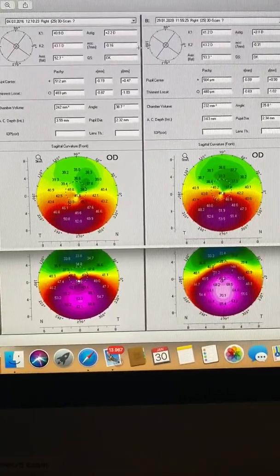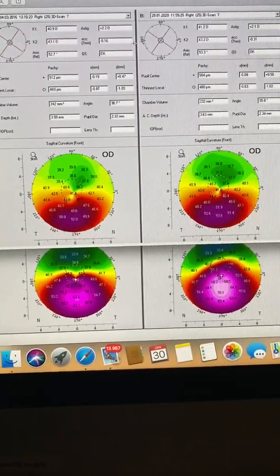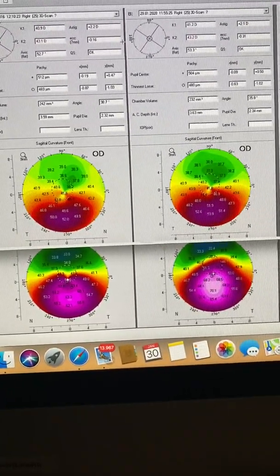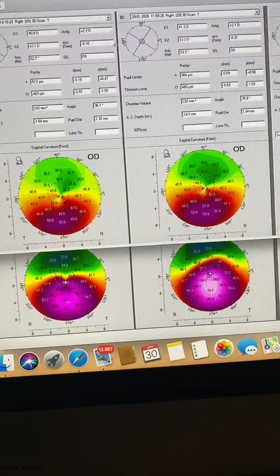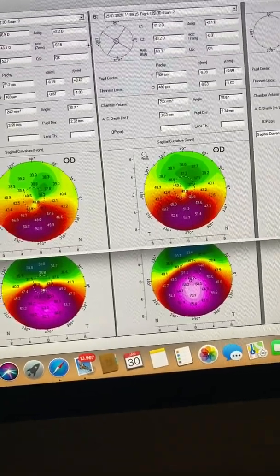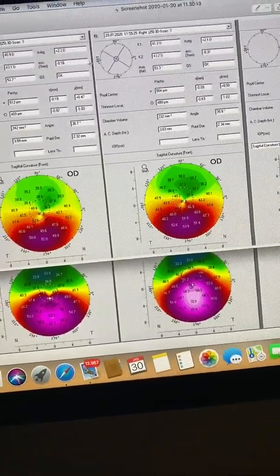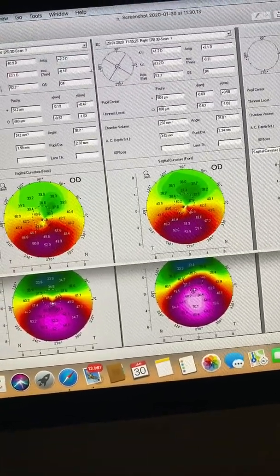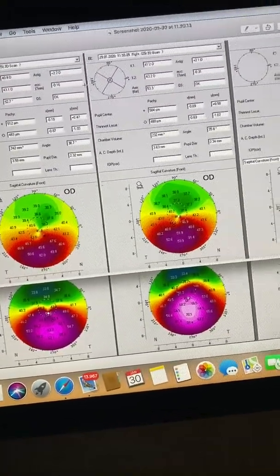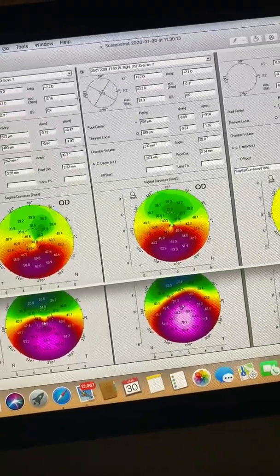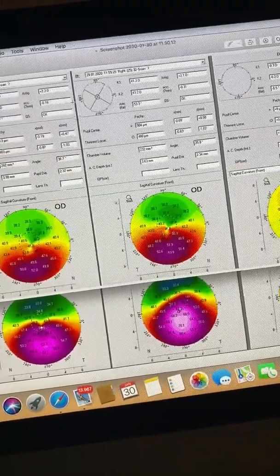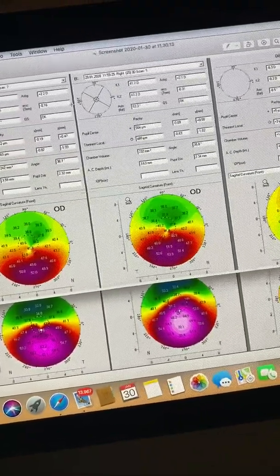It's January 2020. We have a 42-year-old Greek gentleman who we have been following for almost four years. We have images of him from 2016. He has the diagnosis of keratoconus.